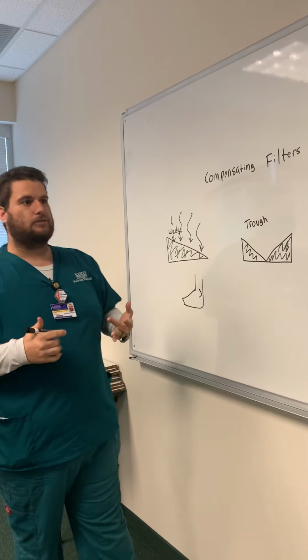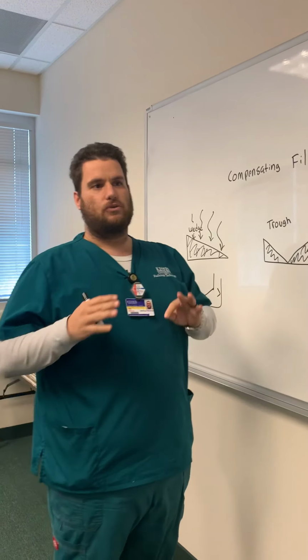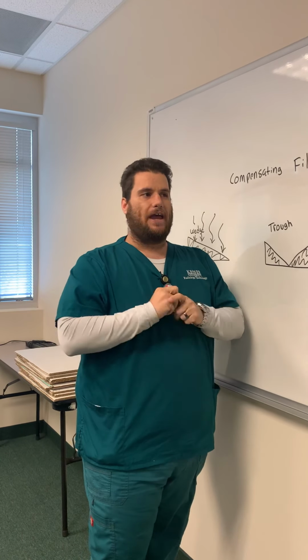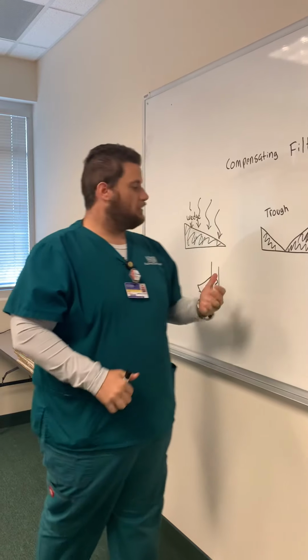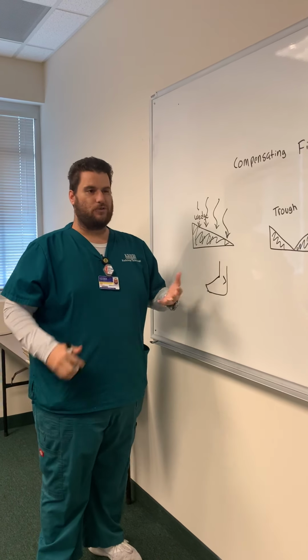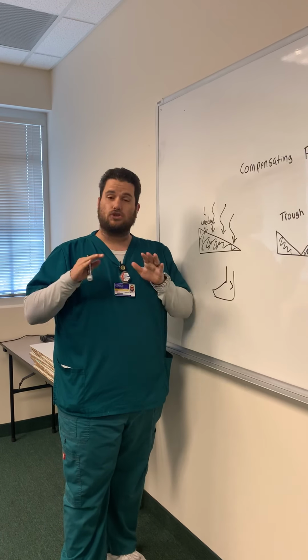So all in all, this whole presentation is about how to avoid overexposure and to show that with filters you can take away those harmful X-ray photons, those low energy photons.